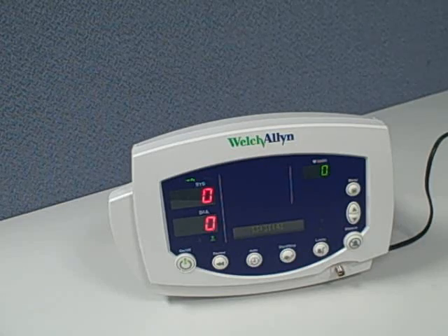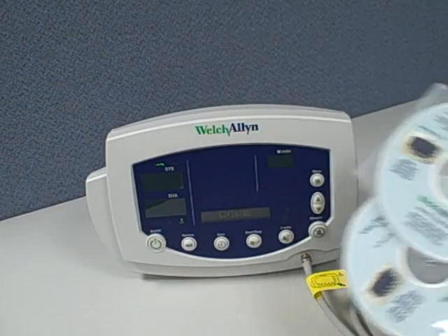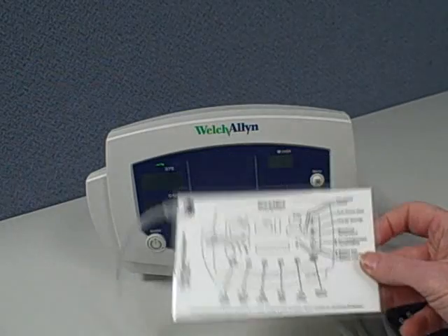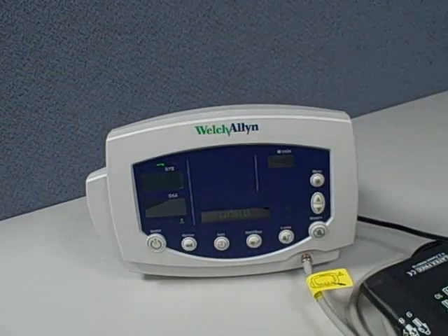An internal rechargeable battery is standard. Also included in the package are directions for use in 10 languages, and a convenient hang tag that can stay with the monitor that points out all the important buttons and readings that you need on short notice.